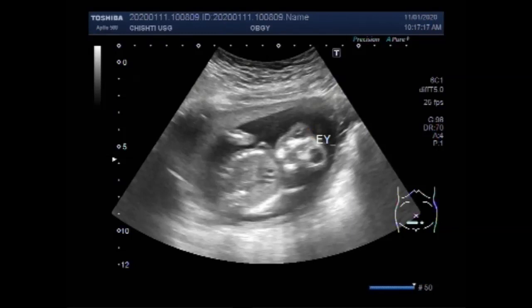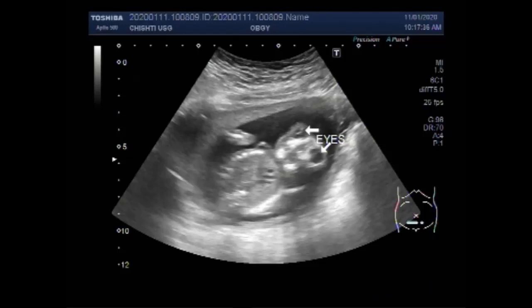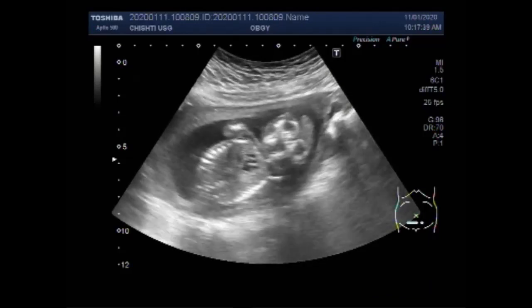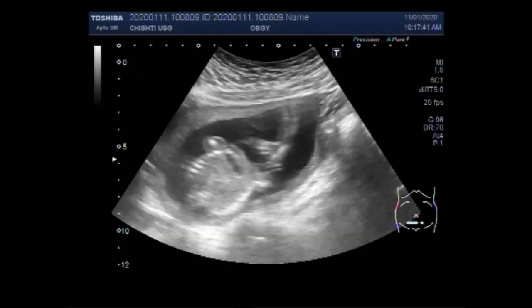These are both eyes. Anencephaly is a lethal congenital anomaly that can be detected on ultrasound as early as 11 weeks of gestation. If some amount of neural tissue is present, the condition is termed exencephaly.